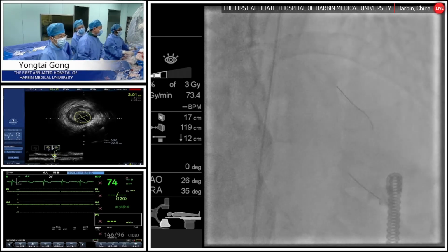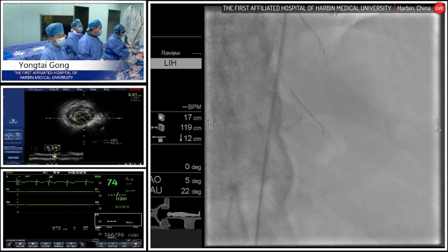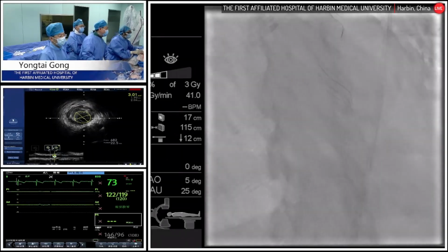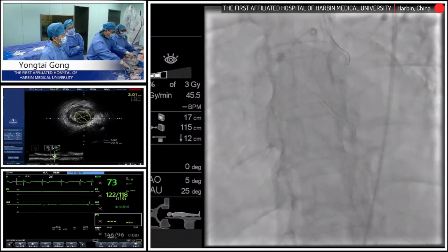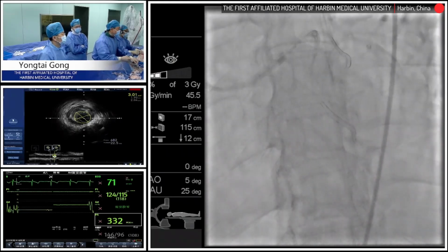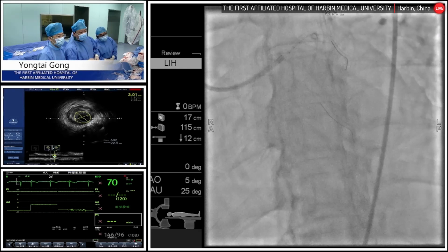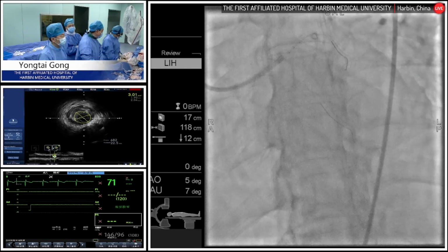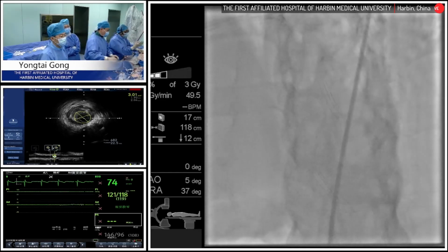Of course. Okay, we are performing the equalization. Once again, I introduce that this is a microcatheter-based FFR, so it's of great convenience for the clinical usage. Okay. Equalization. Yes, he's doing it. Did we flush the microcatheter using saline? Okay. Very good. Okay. Next.